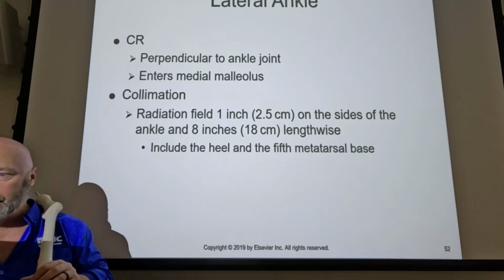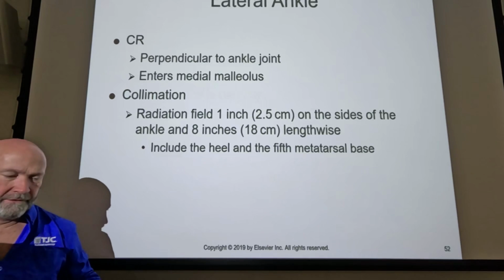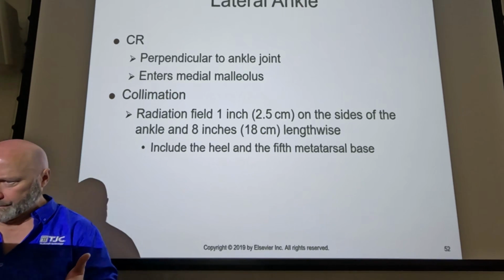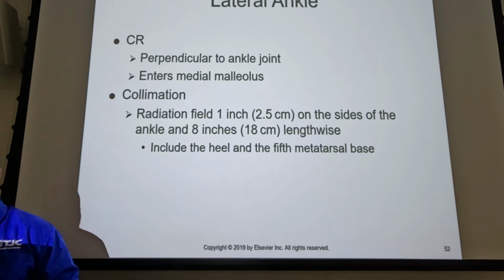And by highly unstable, what I mean is that in a normal ankle fracture, you ask the patient to pick their leg up so that you can put the image receptor underneath them. Say, I need you to lift your leg. And they pick their leg up, and the ankle comes with them. And with this type of fracture, what we refer to as a Maisonneuve fracture, and it's a French spelling, it's in the notes, I'm not going to butcher it up here, it's got way too many vowels, I think a U and an X and all kinds of stuff. A Maisonneuve fracture. What happens is as they pick the leg up, the foot doesn't come up with it.